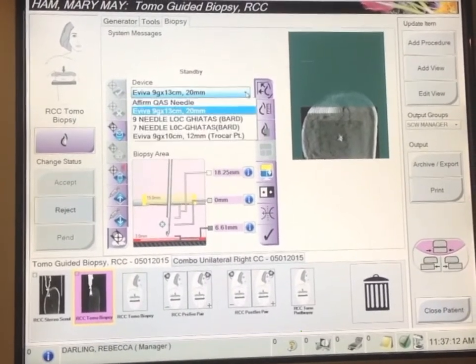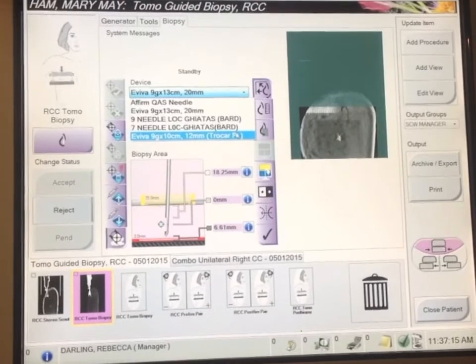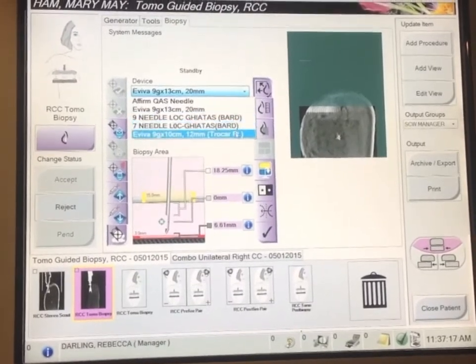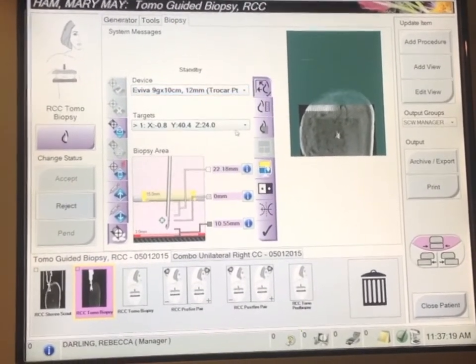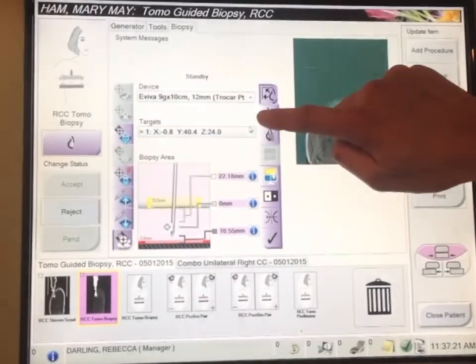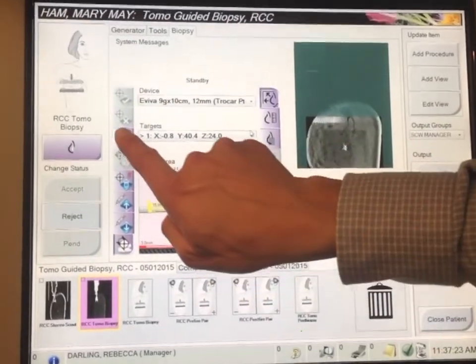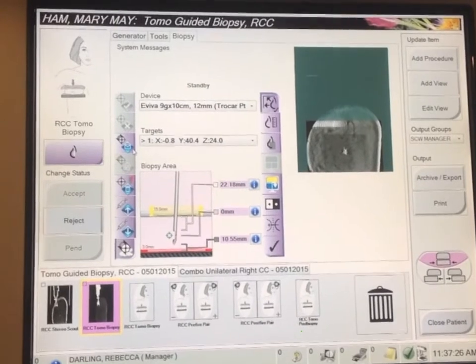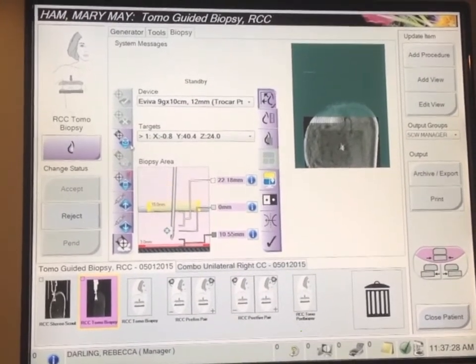You then want to select that check mark on the left which will send it to the device. If it's not the needle you want, select the correct needle. In this case we're using the 12mm Aviva Petite needle. And then finally, once you've confirmed your targets, touch that little mail sign, the envelope sign and it will send it to the gantry.